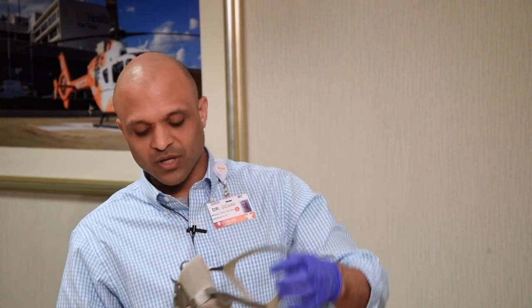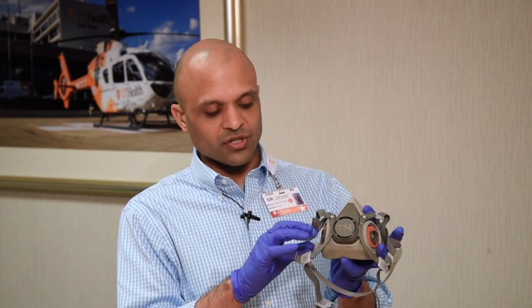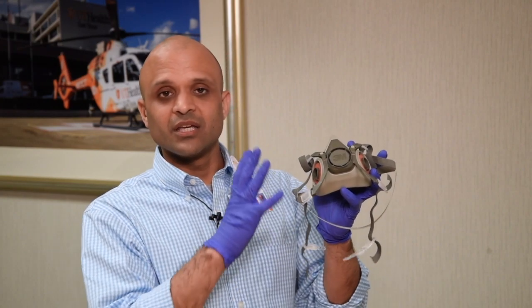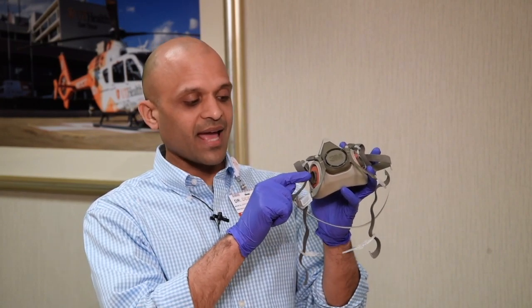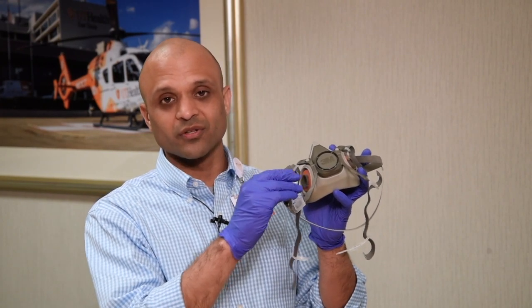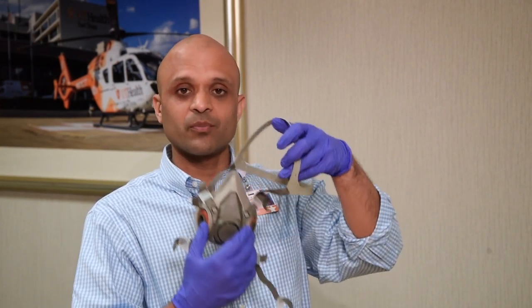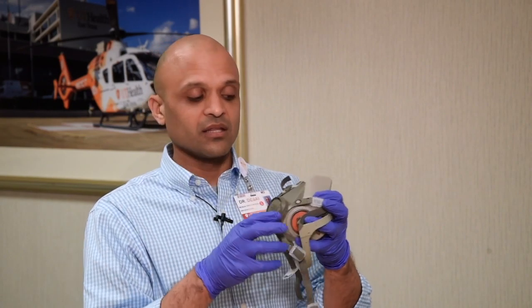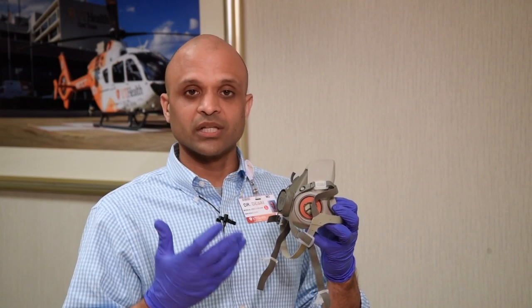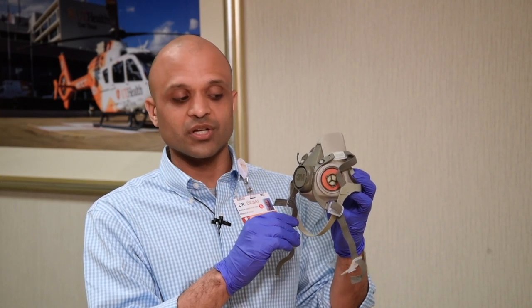A couple of pointers on using this mask: the filter cartridges can screw on and screw off. I would recommend keeping them on so you don't wear out the gaskets or accidentally cause the plastic attachment pieces to wear out. The second thing — in order to get a proper seal, you need to be clean shaven. These masks will not seal with any sort of facial hair, so you really need to be clean shaven to get appropriate protection.